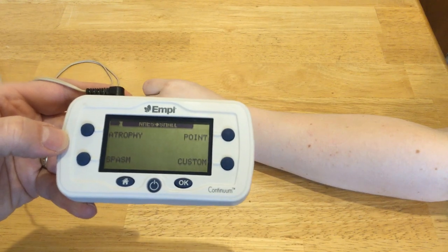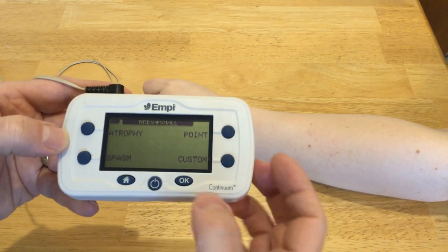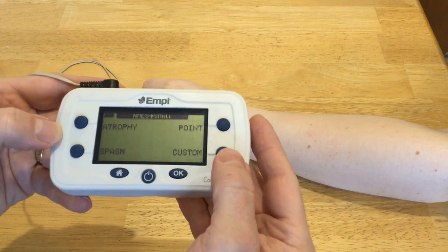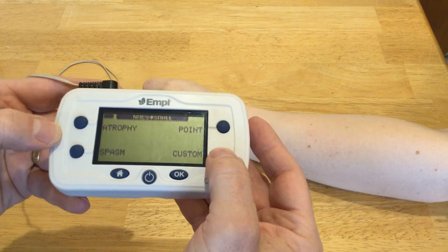It has pre-programmed regimens for atrophy, spasm, and point. I don't want to use any of the pre-programmed regimens. I want to do my own settings, so I'm going to push custom.